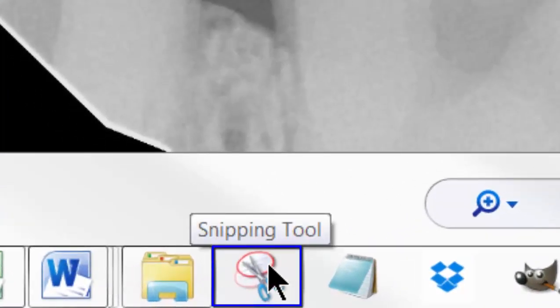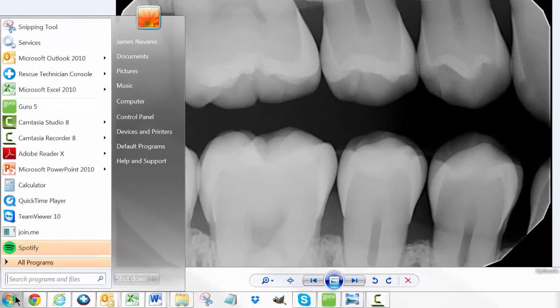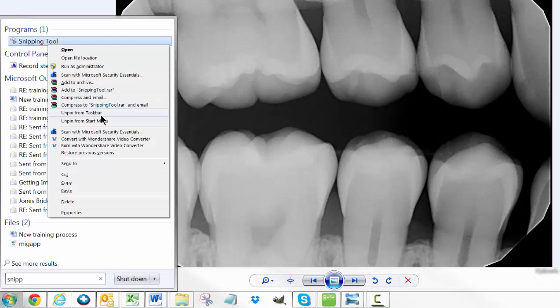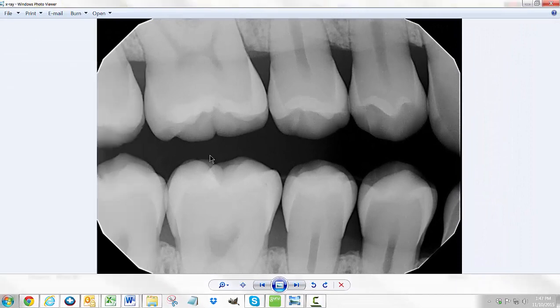I have the snipping tool saved right here in my taskbar — it's these scissors right here. If you don't see it in your start menu, just go ahead and type "snipping" and it will show up. You can right-click on the tool and pin it to either your taskbar or your start menu so you can access it more readily.